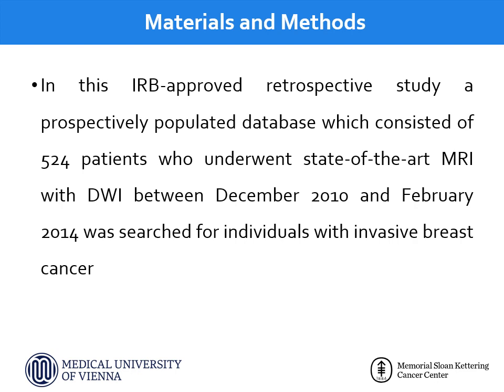In this Institutional Review Board approved retrospective study, a prospectively populated database which consisted of 524 patients who underwent state-of-the-art magnetic resonance imaging with diffusion-weighted imaging between December 2010 and February 2014 was queried for individuals with invasive breast cancer.